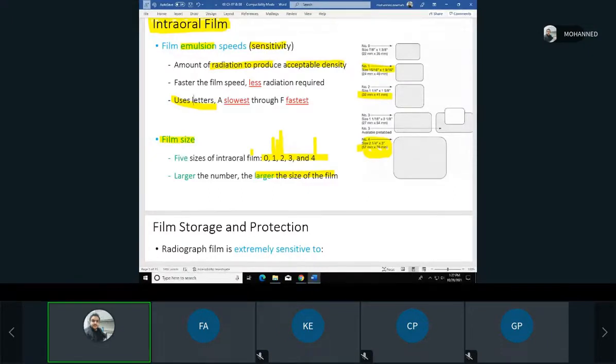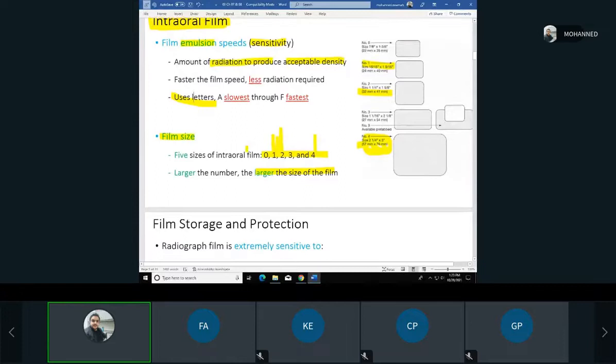Or if they want to see sometimes a tori on the mandible and how much it extends, they might take it. Again, with a pano, it's kind of covering that anymore, most of the time. But some dentists might prefer occlusal just because. Size 4 is occlusal for adults. And we can use 2 for kids as an occlusal. So if it's a child, we can use 2 for them as occlusal. But for adults, it's 4. Any questions about that?